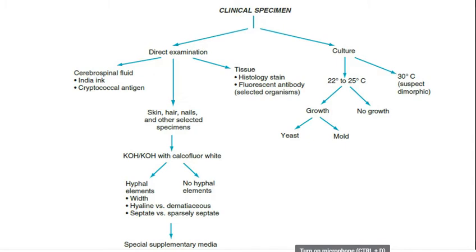Okay. So especially, growth rate and all of those, you go back again to the colony morphology and all. Most especially yung kanilang temperature, para makita mo na agad dun sa culture, meron ka nang idea kung ano yung fungi. Nag-grow ba siya sa ganitong temperature o hindi? Okay? So, yun sa direct examination ninyo.